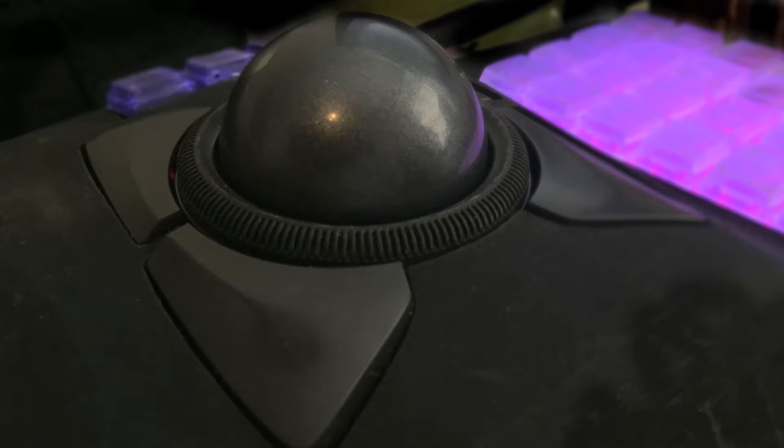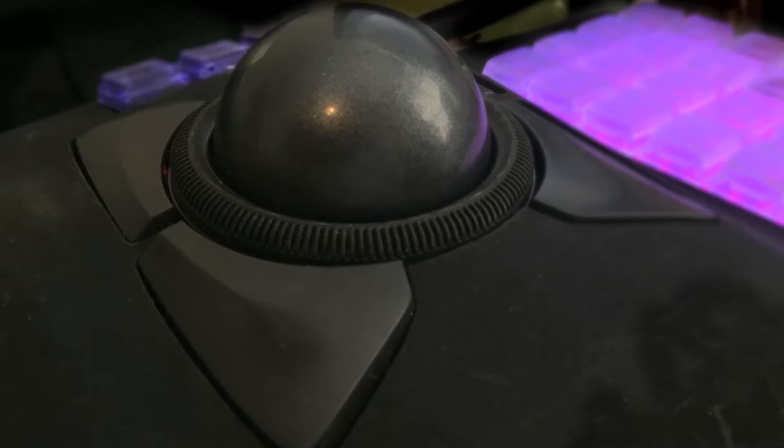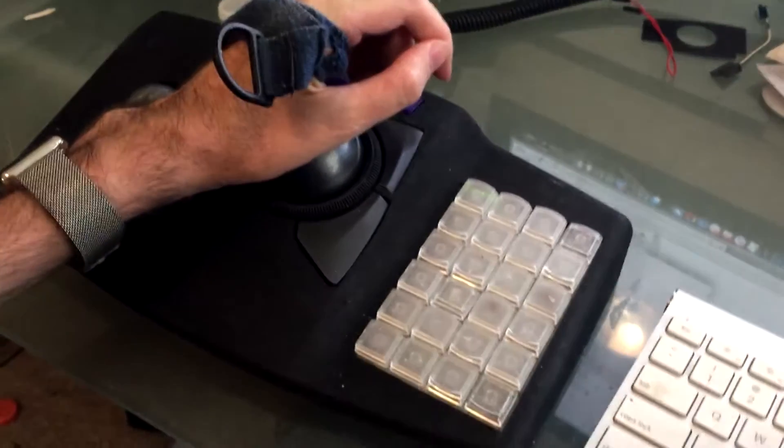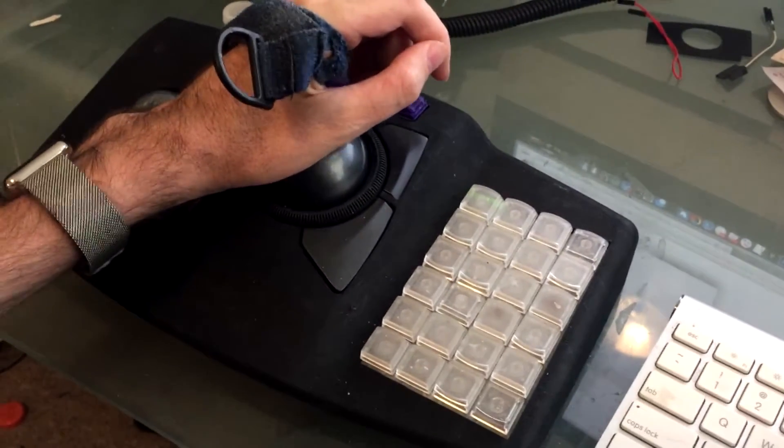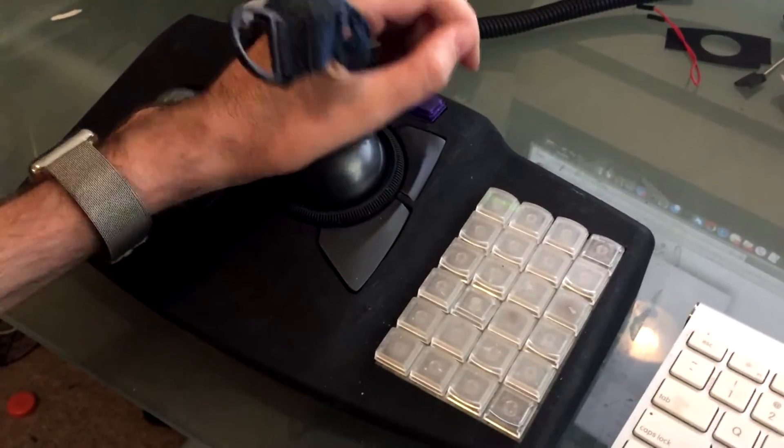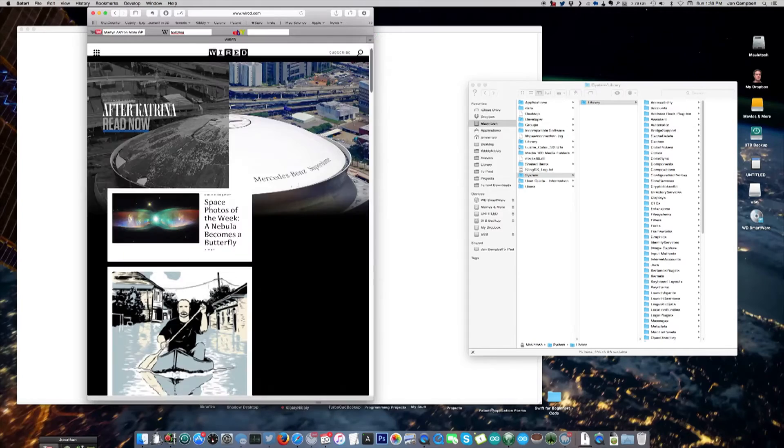The trackball was the first thing I switched to after I was injured. It's easy to use and I can program one of the buttons to be a click lock, which allows me to click and drag on my screen.